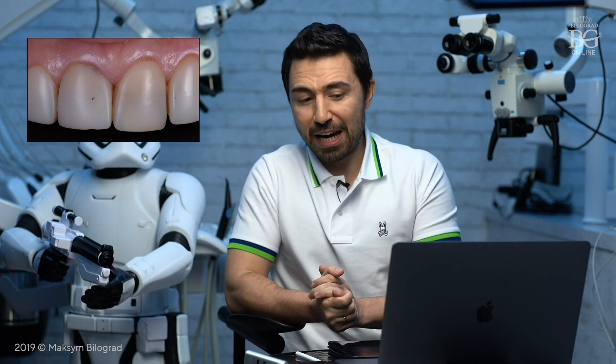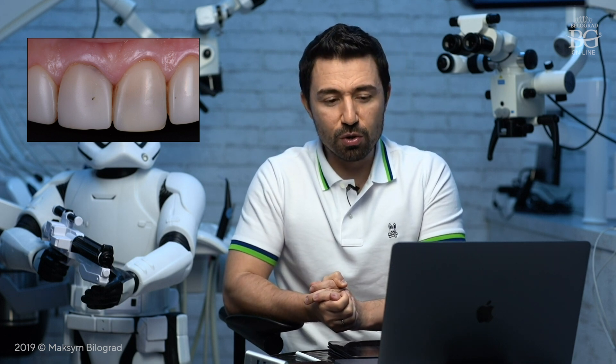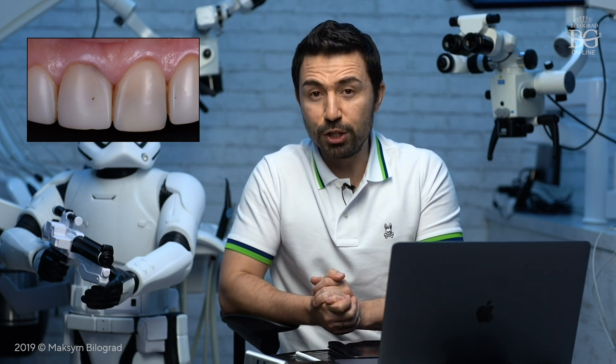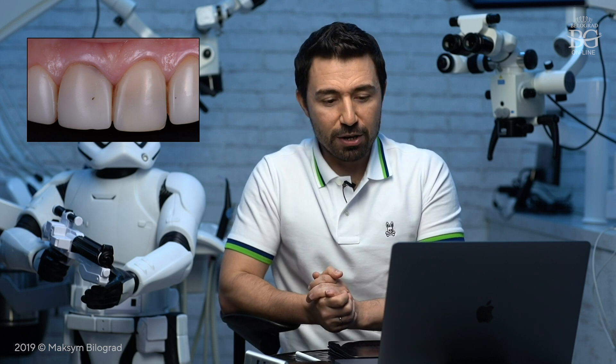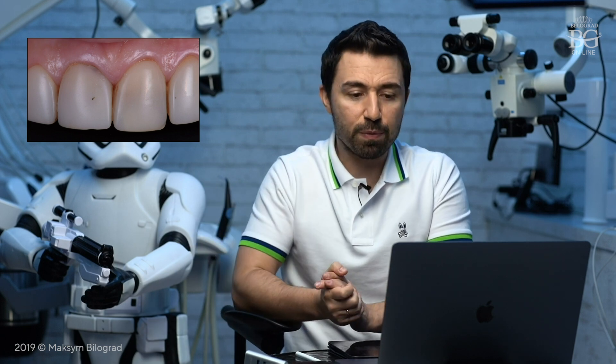This time I would like to present an interesting case related to the benefits and advantages of prepping teeth with rubber dam. The case is about replacement of old composite veneers and composite crowns with new ones made of porcelain ceramic.